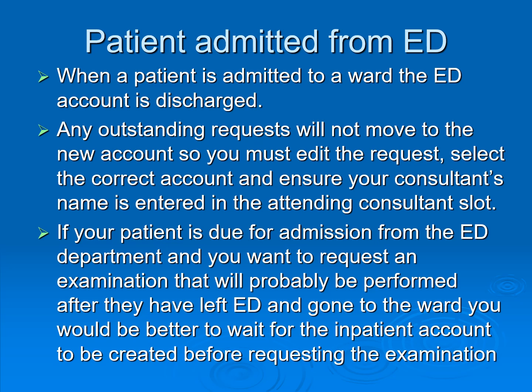If your patient is due for admission from the ED department and you want to request an examination that will probably be performed after they have left the ED and gone to the ward, you would be better to wait for the inpatient account to be created before requesting the examination. This slide will be repeated later.